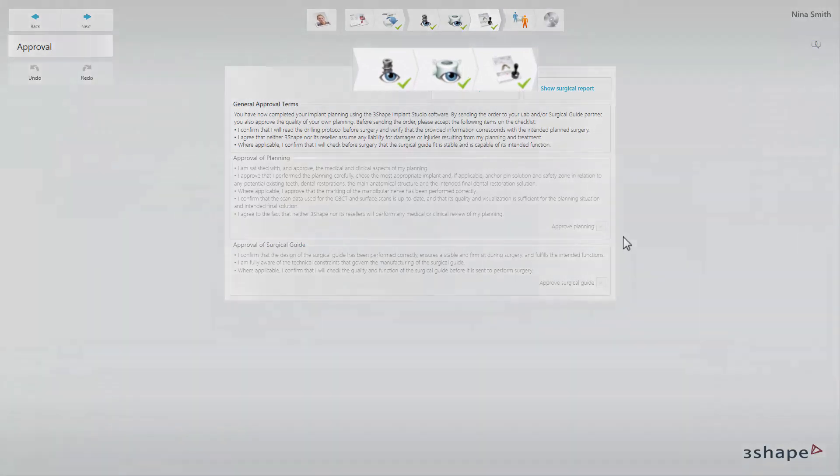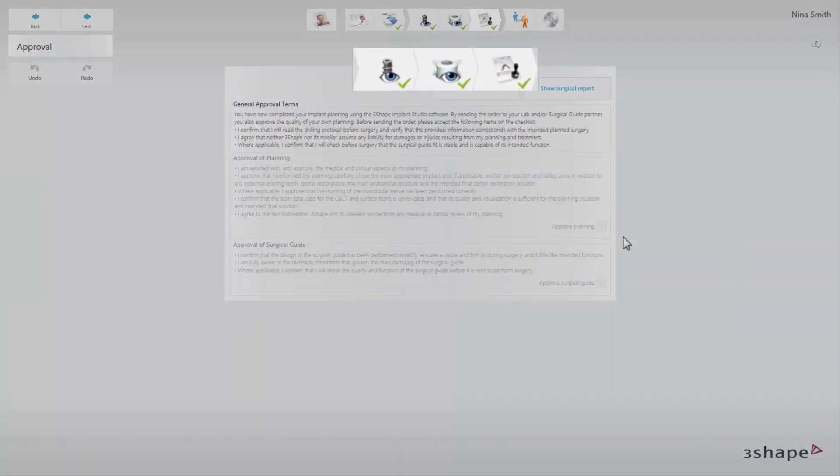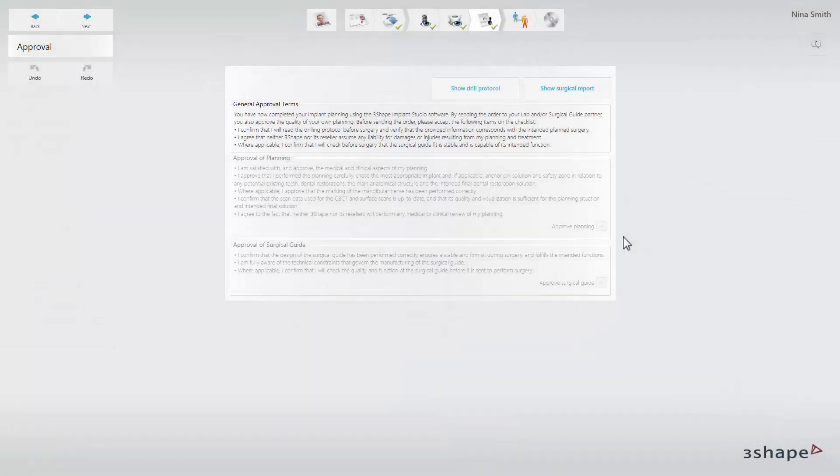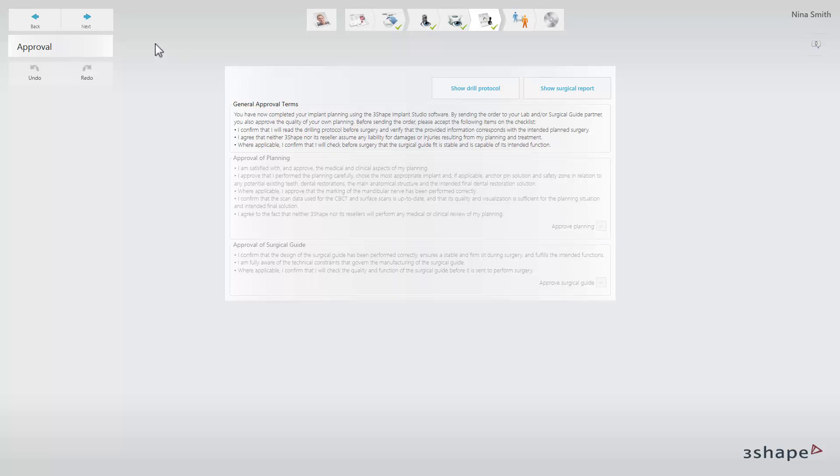However, you can still view the approved planning and guide design in the viewing mode. If you need to modify an approved case, this can only be done by going back to the patient or case manager and copying the case. The copy will include all the case details as in the original case, but it will not be approved, so you can make changes.